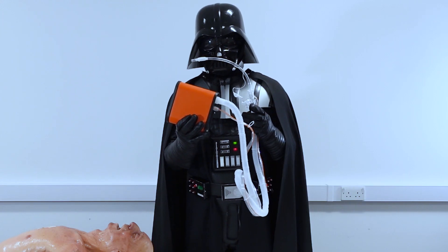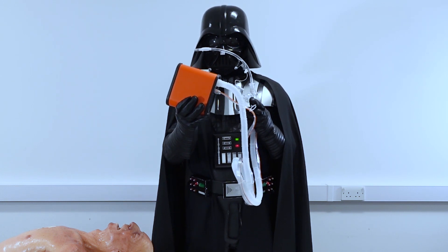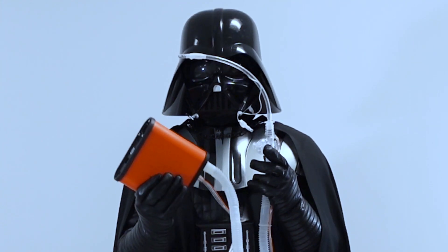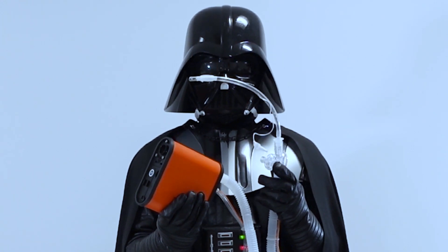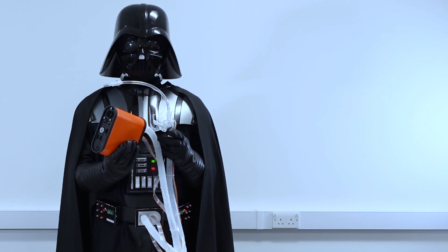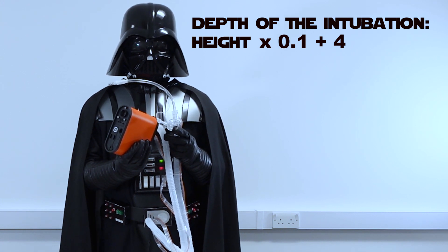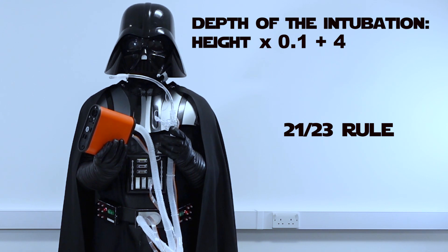Some educated fools will tell you that the most important link of the mechanical ventilation chain is the ventilator itself — that's not true. The best machine will be useless if your patient's tube is misplaced or the cuff is not inflated properly. Therefore please check the depth of the intubation, which should be your patient's estimated height times 0.1 plus 4. This is the so-called Chula formula and it's clinically superior to the 23-21 rule.